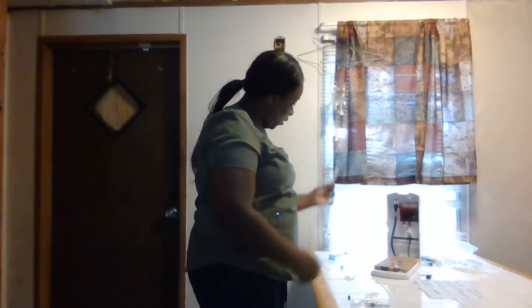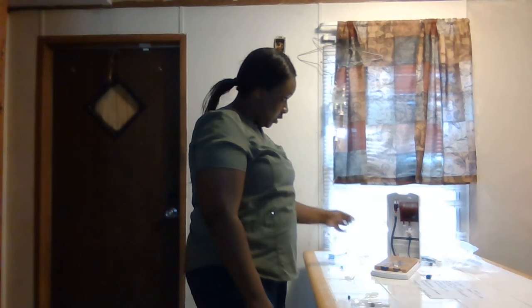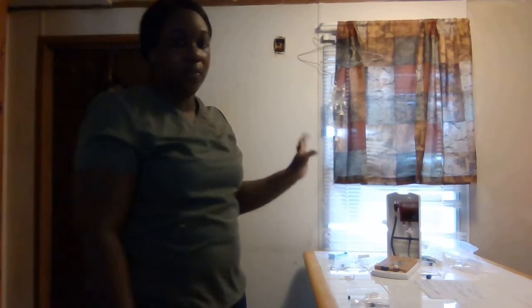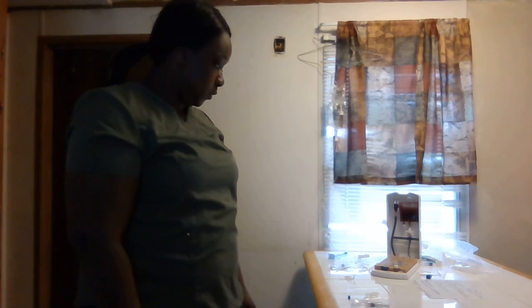Yeah, we flush it, and then we'll remove our dead end off of our primary, attach it, secure it with tape, and turn the pump back on. Again, we won't program the pump, but we'll click that it's an existing patient, because he just went down to X-ray.